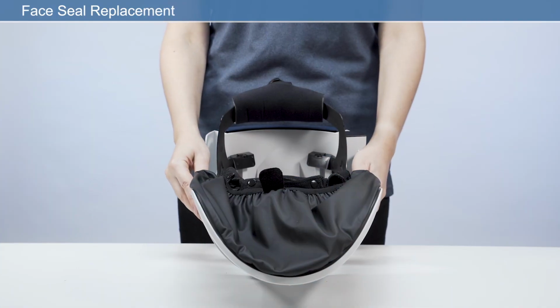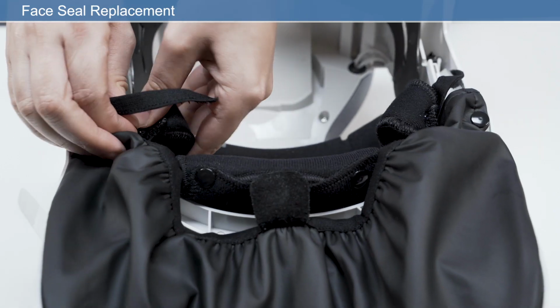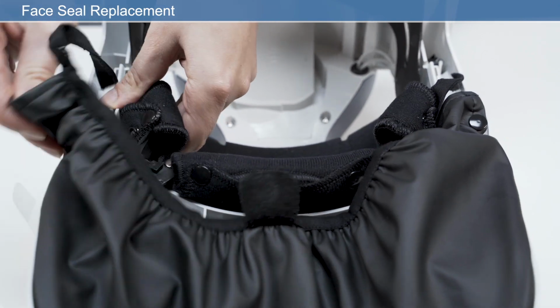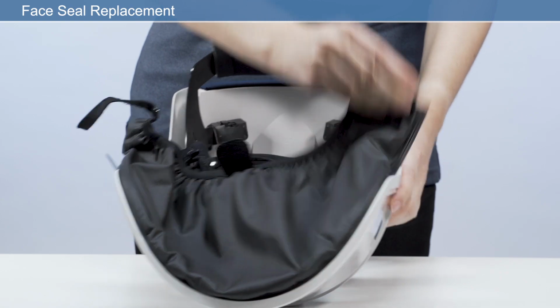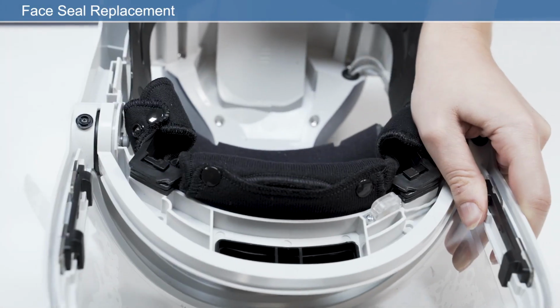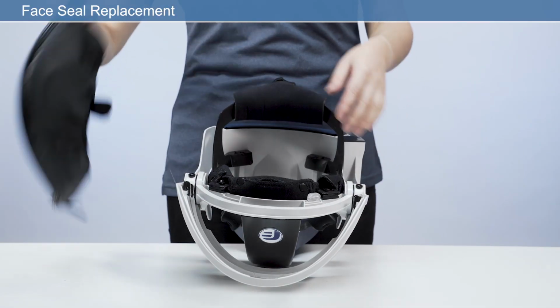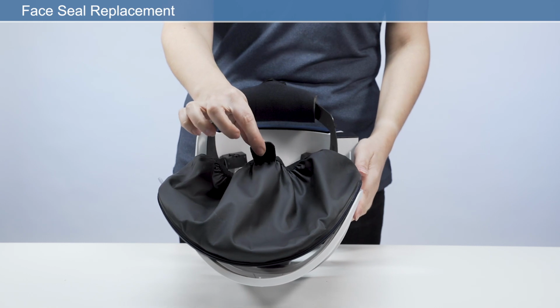To replace the face seal, first detach the elastic straps from the brow pad and remove the visor frame on both the left and right sides. Remove by pulling the rubber seal out of the channel. Then, to fit the new face seal, ensure that the pull tab is on the outside of the face seal.